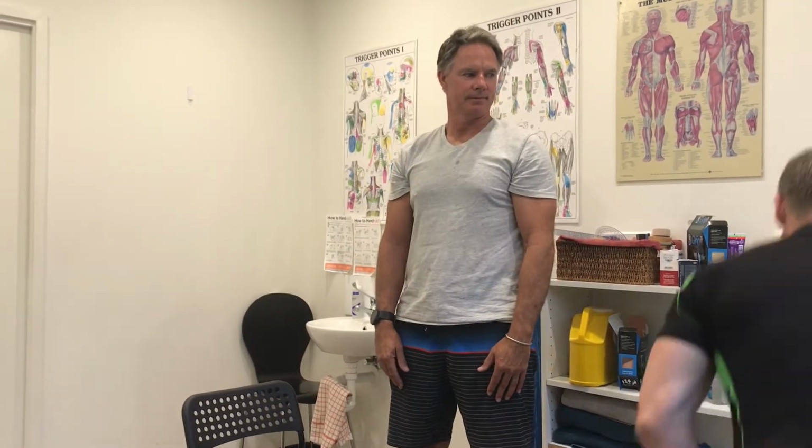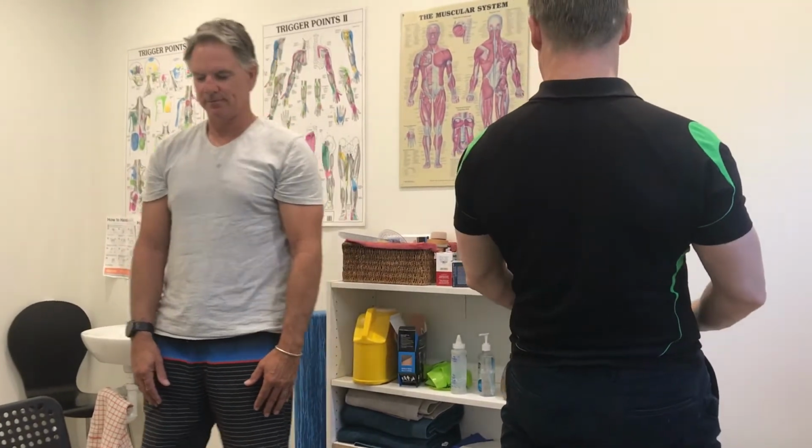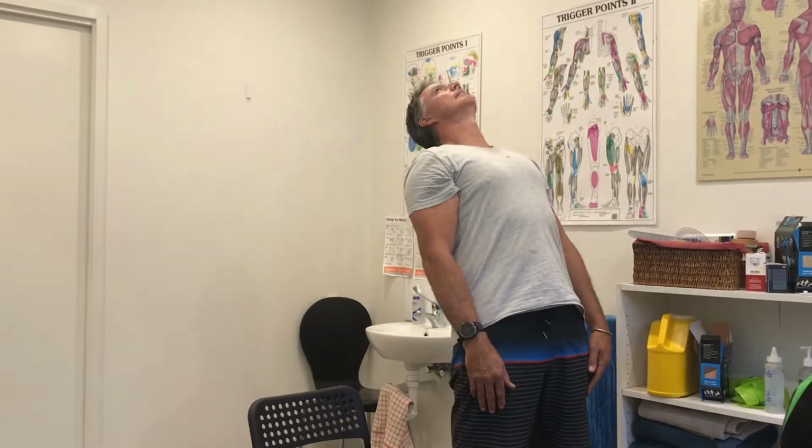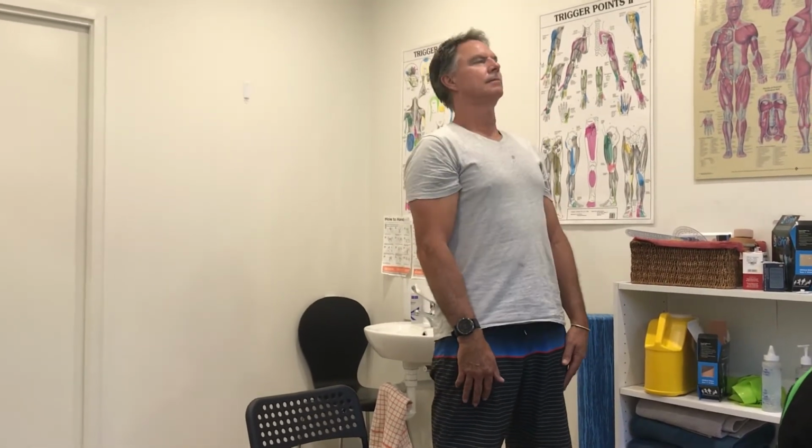Next one's extension, so that's going to be just leaning backwards like that, not your head, just your lower back, and then come back again. Don't hang around down there. When you can't go any further, you come back.